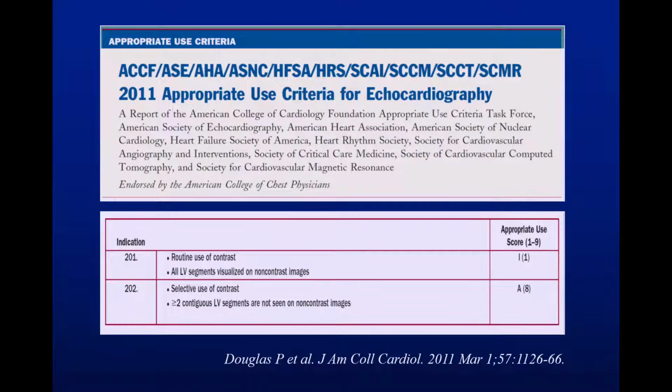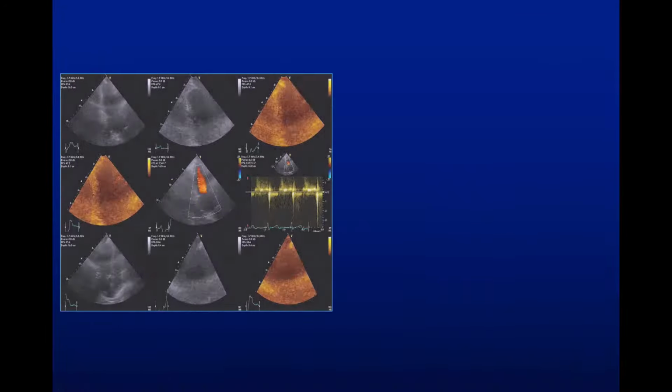Before that, these are the appropriate use guidelines from the various societies telling us that appropriate use of contrast is if you need enhancement of these images for you to be able to do that. If you're seeing all the segments of the heart, you certainly don't need to use contrast.